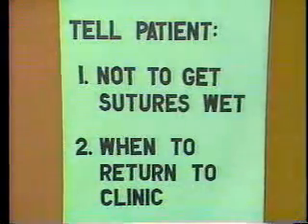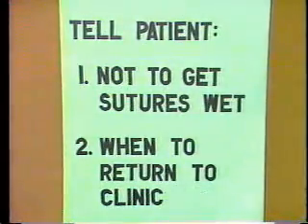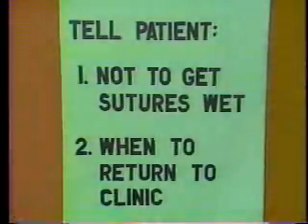After suturing the patient's wound, follow-up nursing intervention includes teaching the patient how to care for the wound. Follow the SOP of your clinic in providing patient education. In many instances, the patient is told not to get the sutures wet. The patient should also be told when to return to the clinic for suture removal. This is usually done in several days.